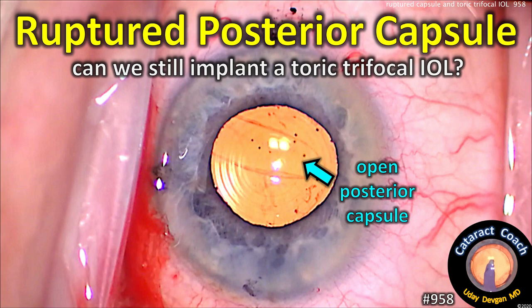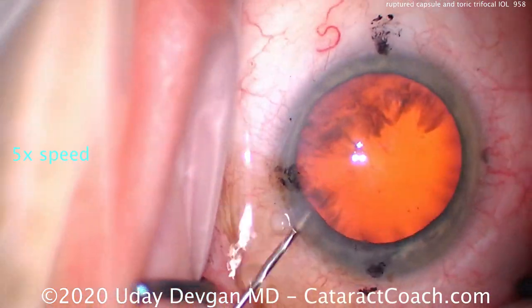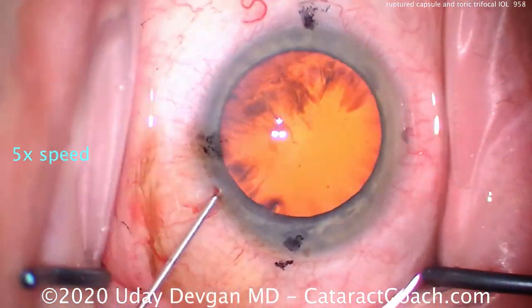cataractcoach.com — ruptured posterior capsule: can we still implant a toric trifocal IOL? This is not going to be an easy case. Let's go through the routine part of the surgery.